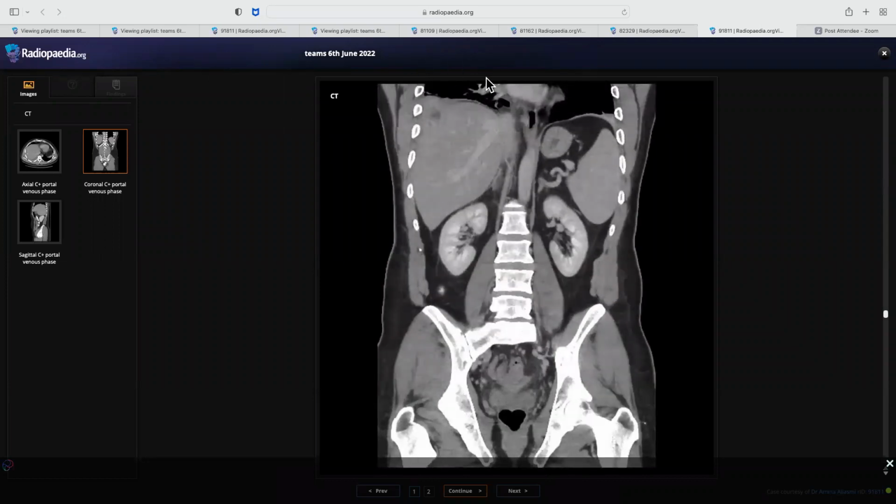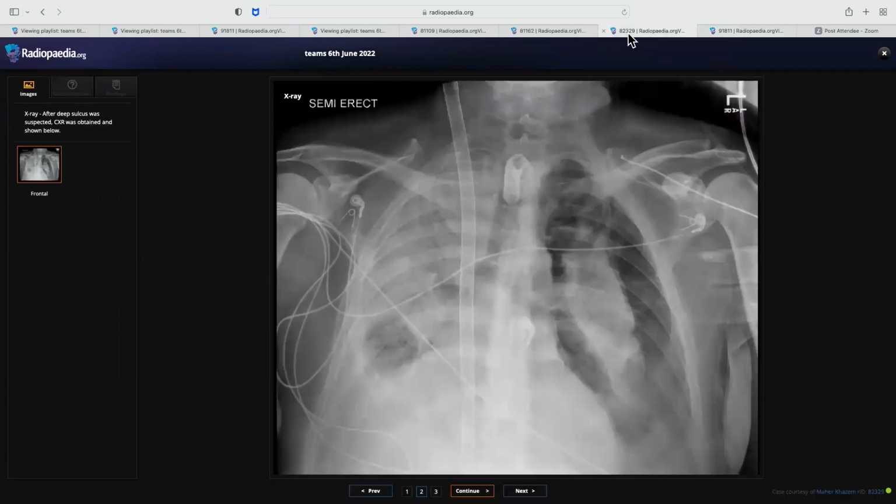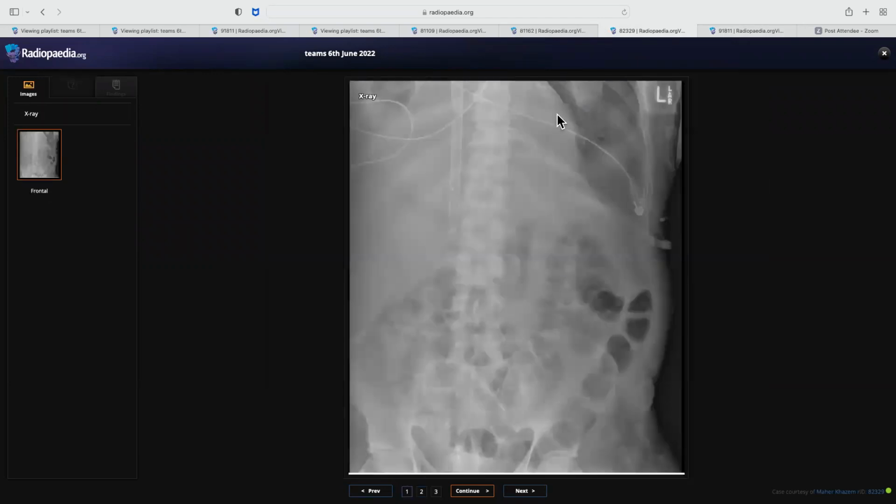The only thing is, when we hear abdominal surgery and a stone, appendix stone, we should think about that. That's why I kept that case. This was the deep sulcus sign, very well identified. The only thing is, when you see a sign like that, it should come up quickly, not after the examiner asks so many questions, because the more hints they give, the more points we lose.